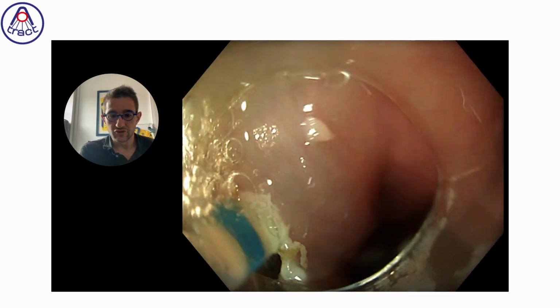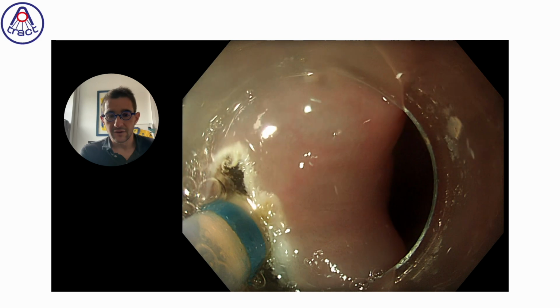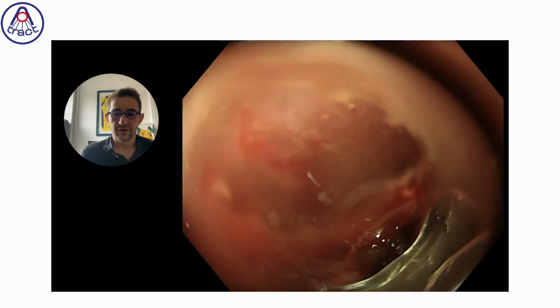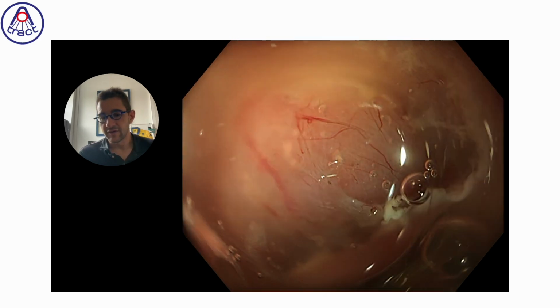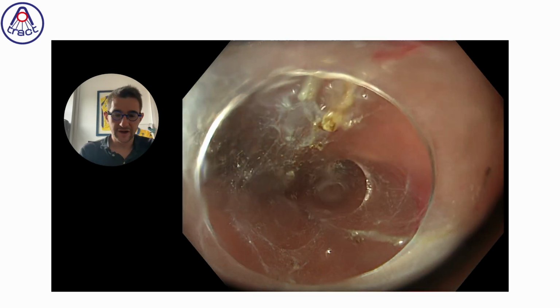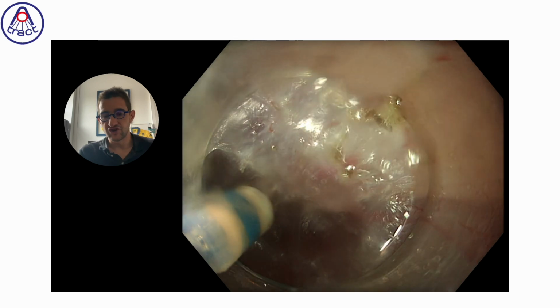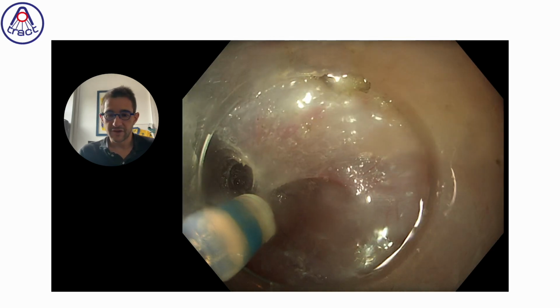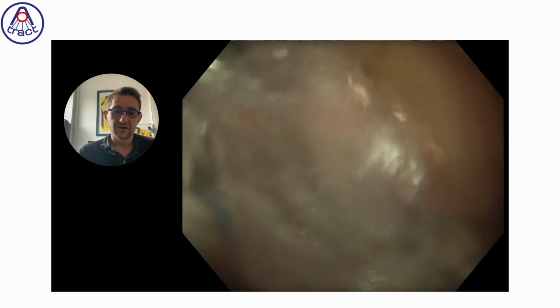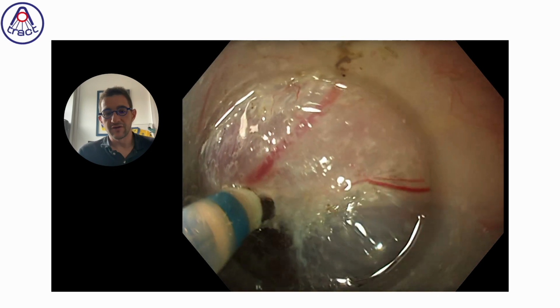It is important also to control the vessels relatively quickly in the esophagus in order to avoid mixing blue injection and blood in the submucosa. It is always more difficult to analyze the submucosa and to see where we are if we have not a perfect blue injection but a mix of blood, because when you use the knife, for example, it is usual to have a kind of carbonization, a lot of dark tissue when there is blood into the submucosa.